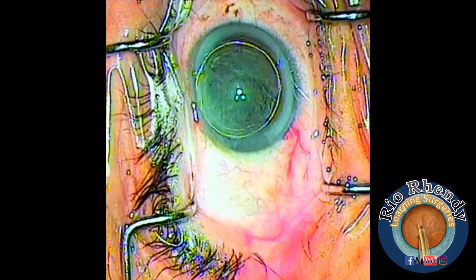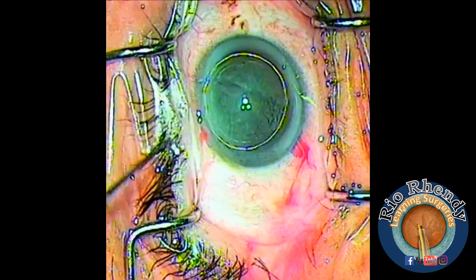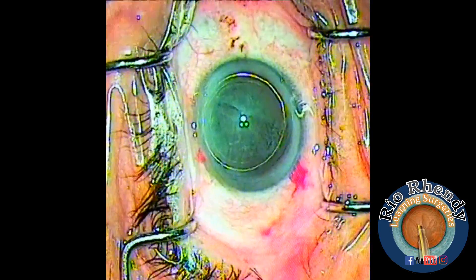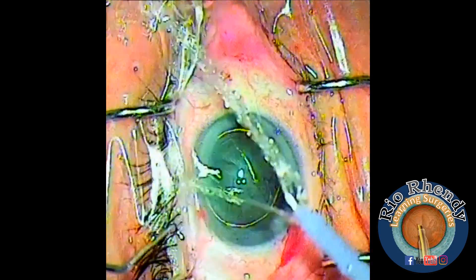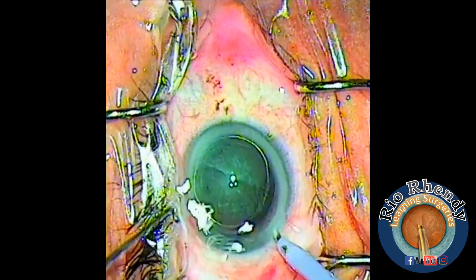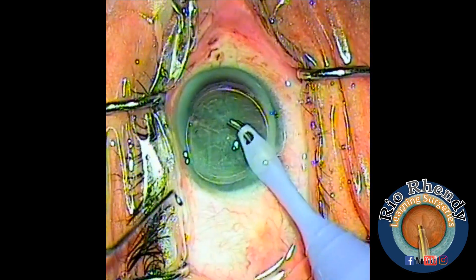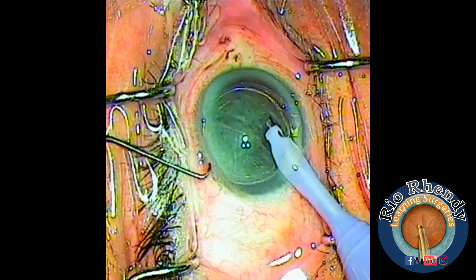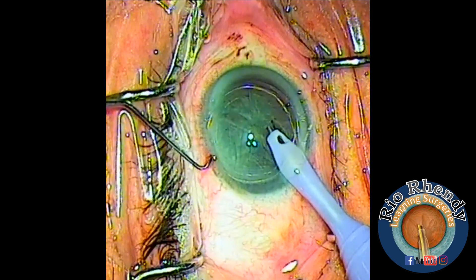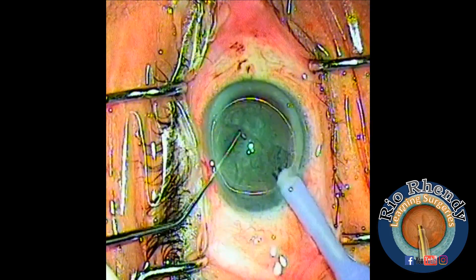Now we have two golden rings from the hydrodelineation. I put some HPMC and then start with the phaco. I'm using an Alcon Infinity machine. As a second instrument, I'm using a long chopper with a blunt edge. I put the tip with bevel down and then rotate to bevel up.